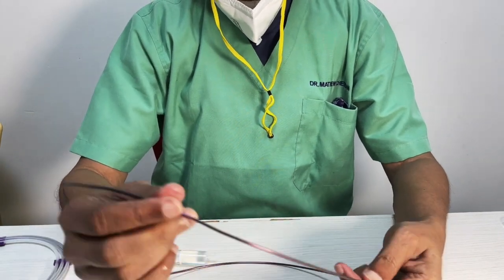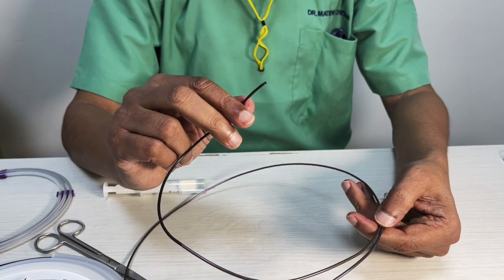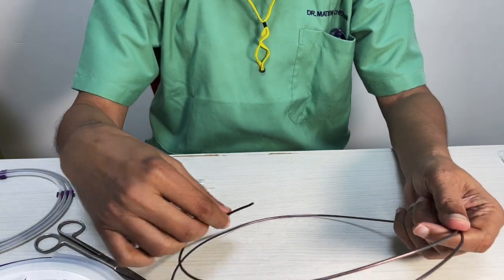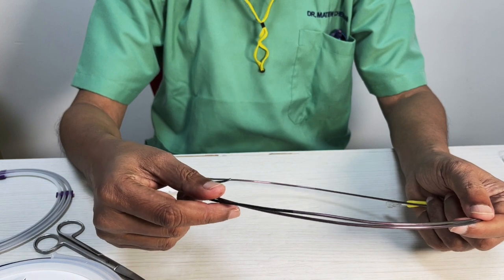Now from here, remember, Navion has an extremely wide lumen. It easily takes 2 devices across, and it's a very good device for taking through very tortuous anatomy, any day better than using a Neuron. But Neuron is pretty straightforward too if you don't have a 360-degree loop that you have to take.